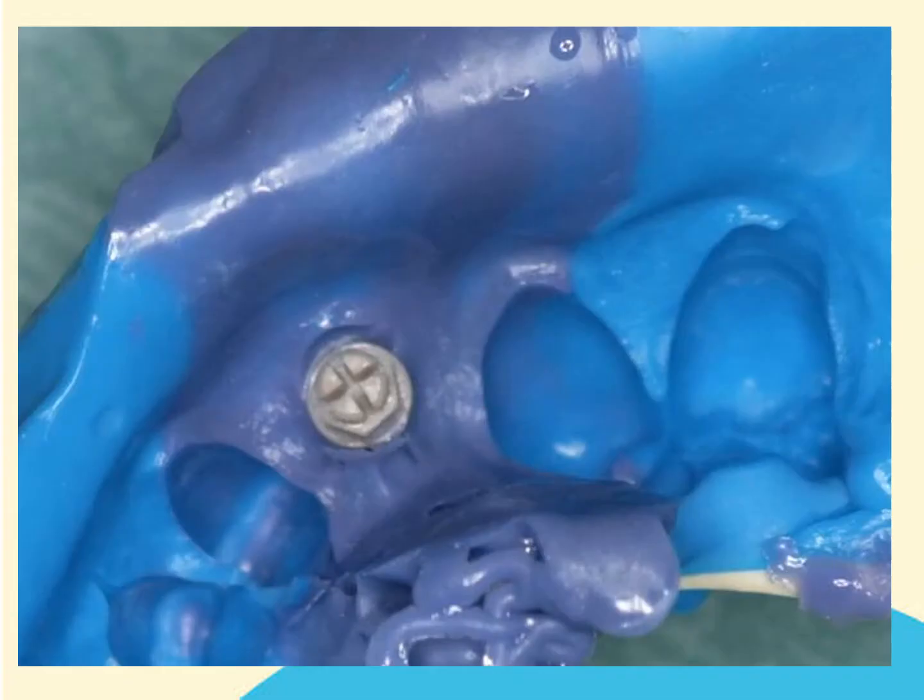When the impression is removed from the mouth, you should clearly see the clicking top secured in the material. If the clicking top has ripped out of the impression, do not try and reposition it into the impression. It would be necessary to clean the clicking top, remove impression material from the venting system, and repeat the procedure.